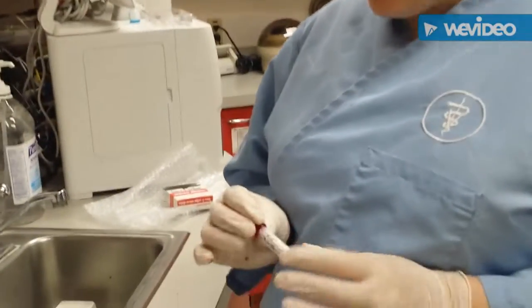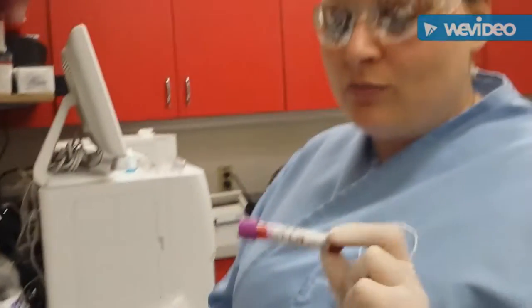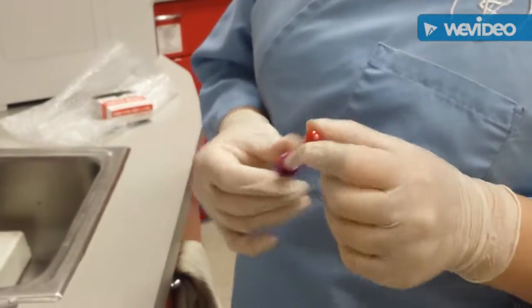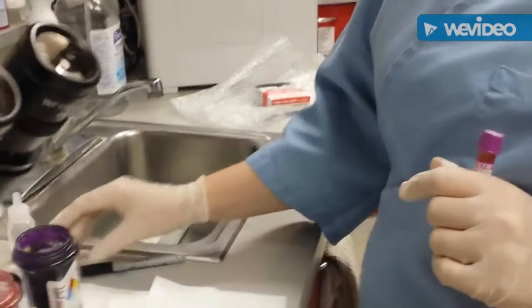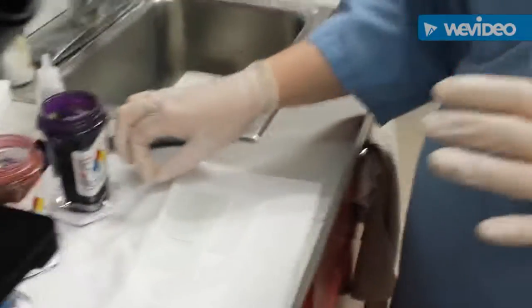So we're going to go ahead and make a couple of slides here so we can view them. We have our fresh tube of blood with an anticoagulant tube, our patient's name, and today's date. Earlier, in a previous attempt, we tried to make our slides using the capillary tube, and we were not successful at that. So the first thing we're going to do is actually use pipettes.